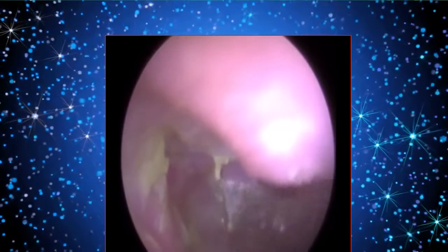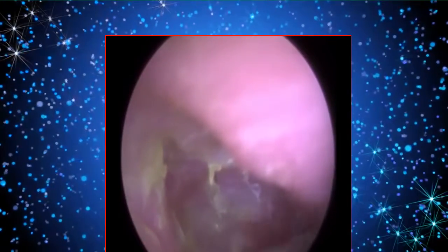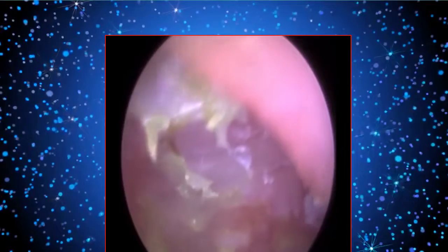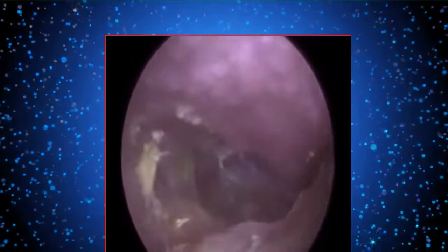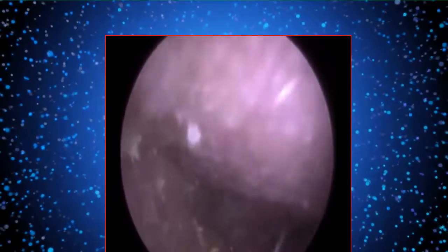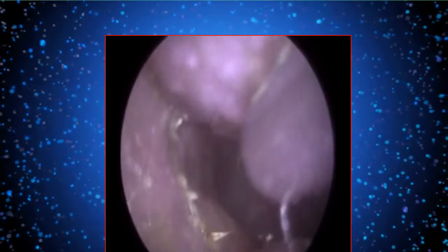We've just got to be careful as well. The longer we're in the ear, because it's swollen already, the more we can increase that swelling. So I just want to do it as quickly as possible. I don't want this ear canal seizing up again, like last week.